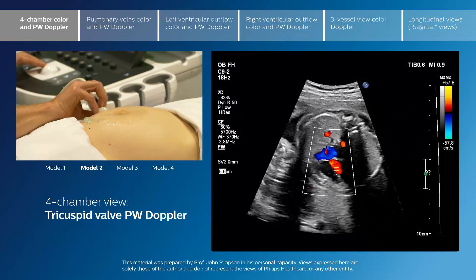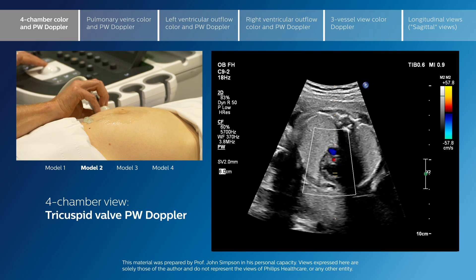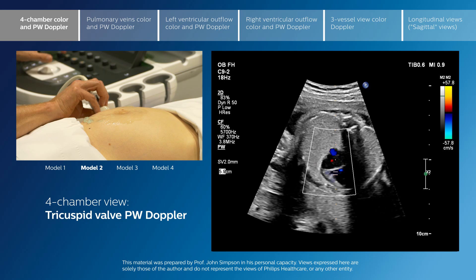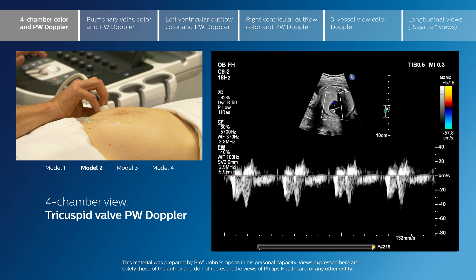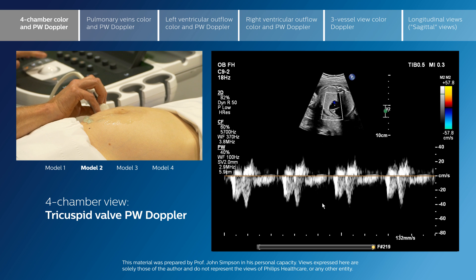When we look at the tricuspid valve inflow signal, we will see the same or similar to what we saw through the mitral valve. On the tricuspid inflow signal we see a similar finding with dominance of the A wave compared to the early E wave, which is normal in the fetal circulation. We should see that there is a biphasic pattern, meaning both the E and A waves are clearly separate across each of the AV valves.